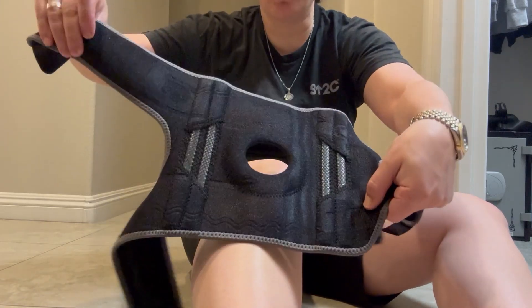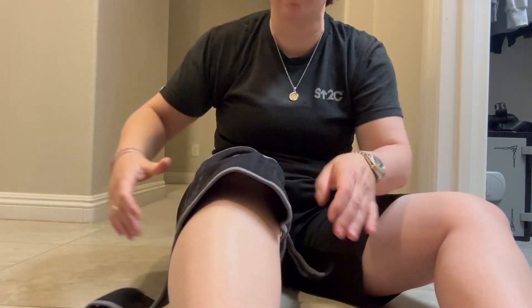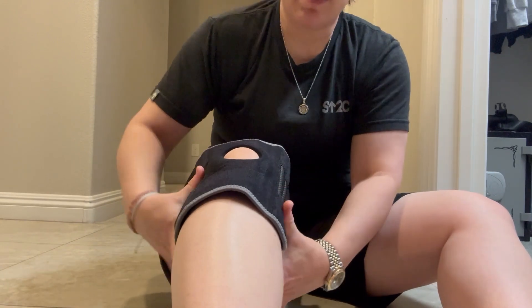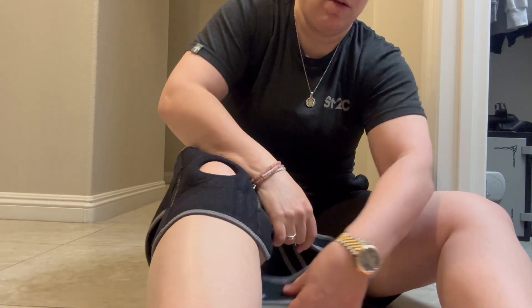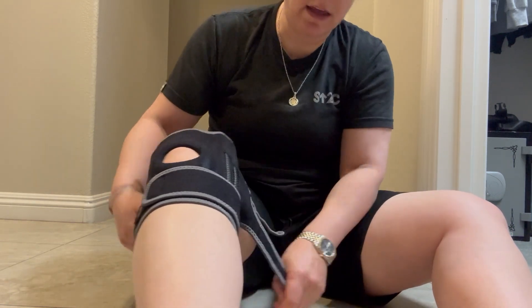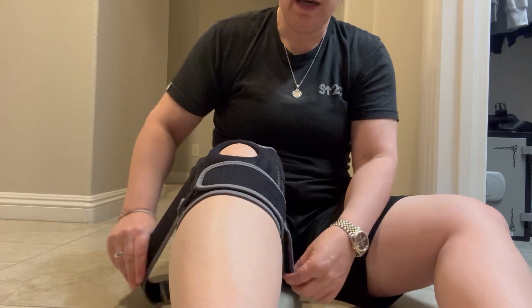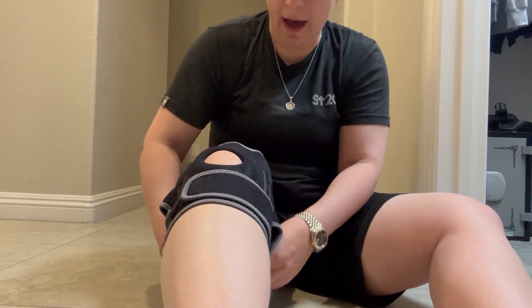So first we're going to start with these larger straps and you can see there's smaller straps on the other side, but we're just going to take this and wrap it around. I found that these are really very true to size also, so I really appreciated that.